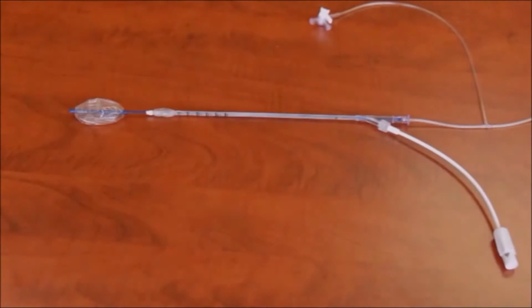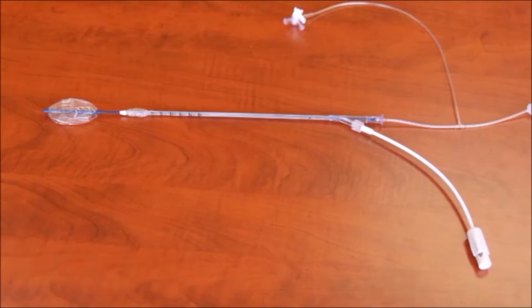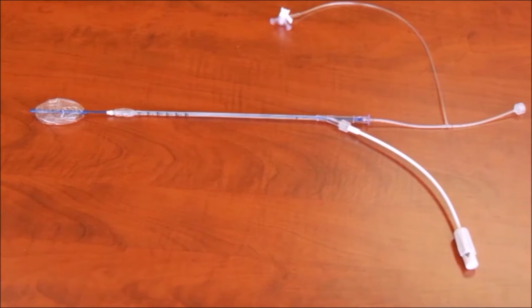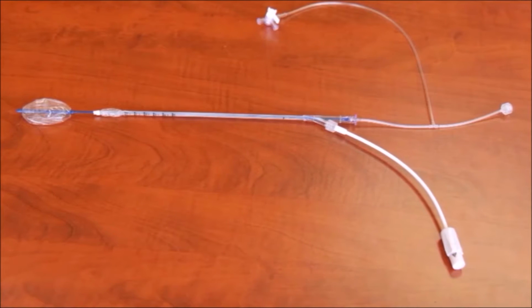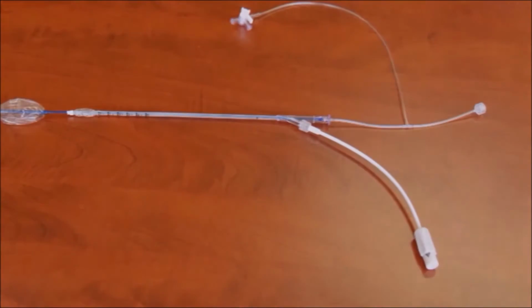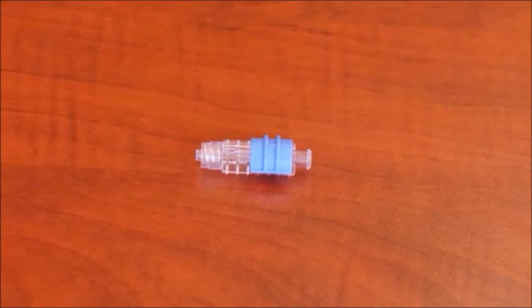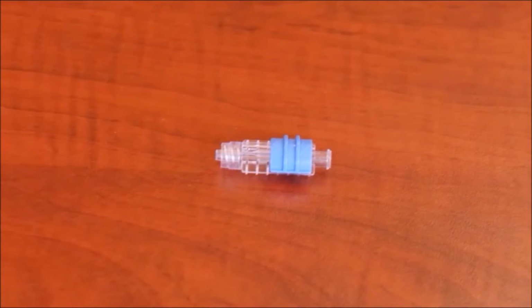The catheter contains both sphincter balloons and a rectal balloon. At the opposite end of the rectal balloon there are two connecting ports that will plug into the fob. One port is for the sphincter balloons while the other contains a luer lock which will help us control the airflow to the rectal balloon. The flow control switch contains an on-off function that allows us to control air pressure inside the syringe and catheter.